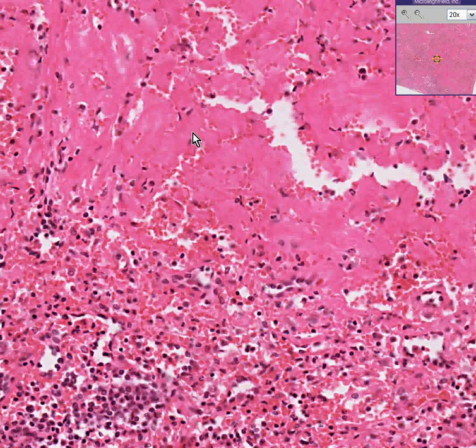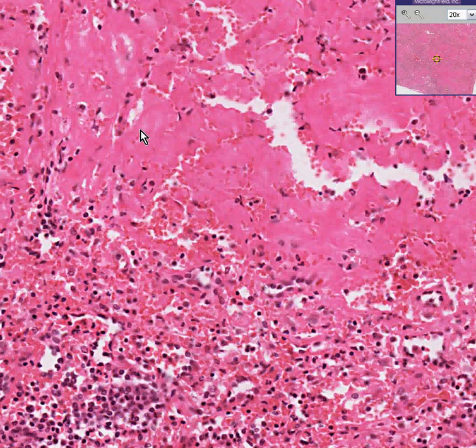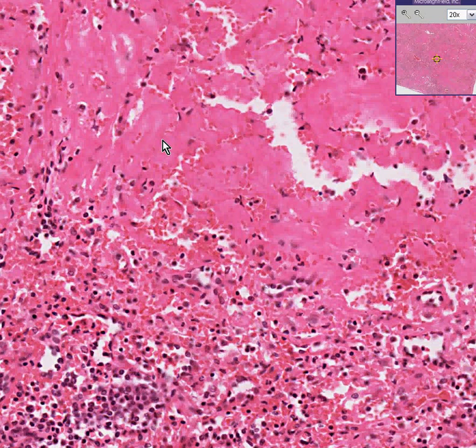It is mixed in with some cells every now and then — inflammatory cells, maybe fibroblasts — but this is, once again, a hyaline material. It is glassy. It is pink. It could perhaps be called finely granular. And for lack of a better word, this is hyaline.